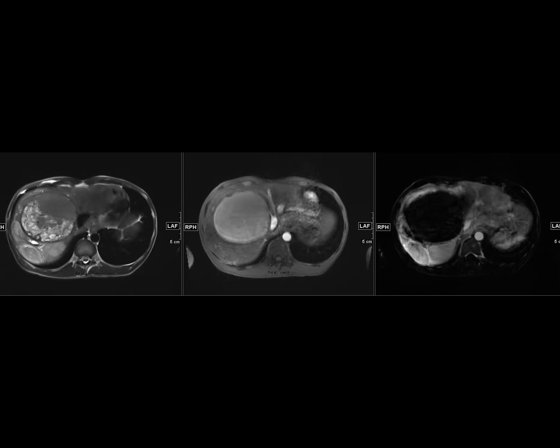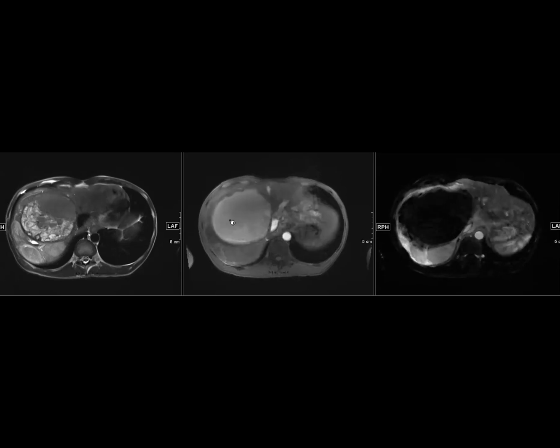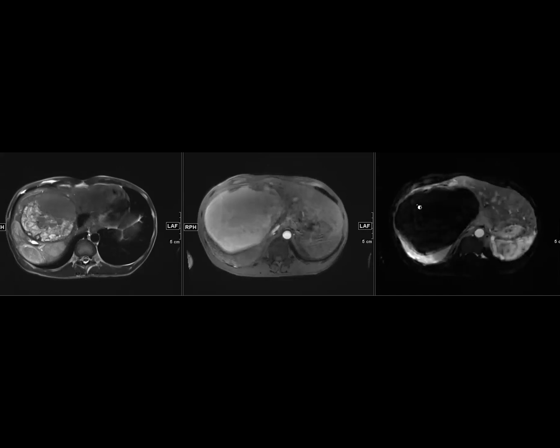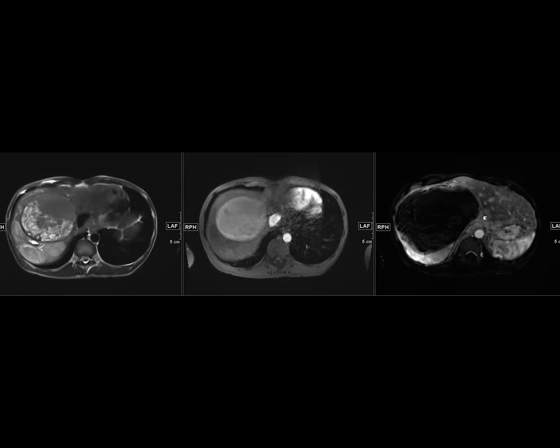Just a question. So the biopsy was done from the big mass or the smaller masses or both? Because the smaller ones look like neuroendocrine mets, but the big one looks pretty weird. It's just hemorrhagic. It just bled into itself. Oh, okay, makes sense. It's all just a huge hematoma mass. If you look carefully at the periphery, these residual areas look very similar to the main masses. So this is just hemorrhagic neuroendocrine tumor. Anything that's hypervascular can bleed. We weren't able to get any history of trauma or anything like that. Somehow he just bled, and he had no pain, nothing. It was all incidentally found.